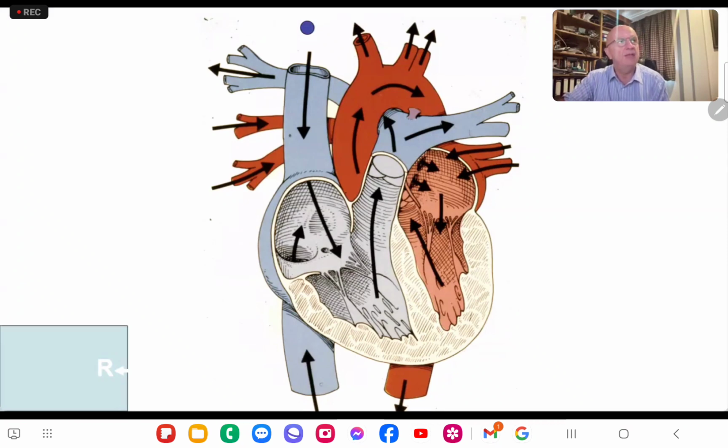You can use the same idea in echo images as well as these anatomical images. There's this small connection between just the bifurcation of the pulmonary artery and the aorta. That's just that fibrous little thing there. That's the position where the ductus arteriosus would exist.